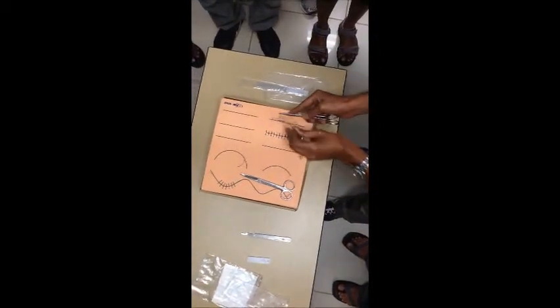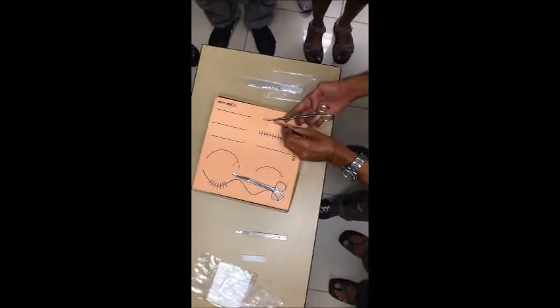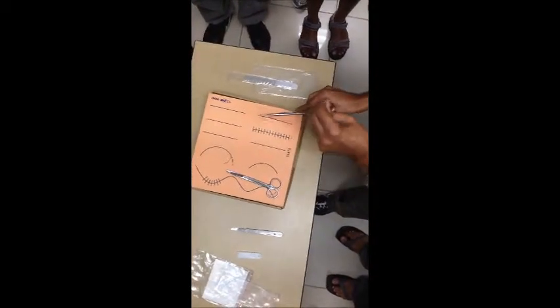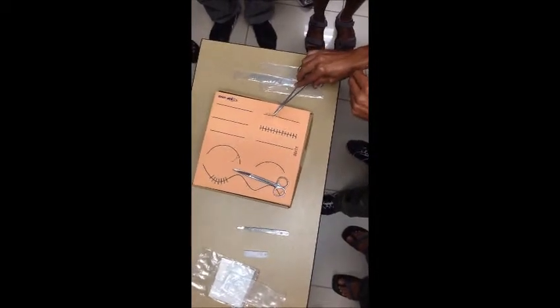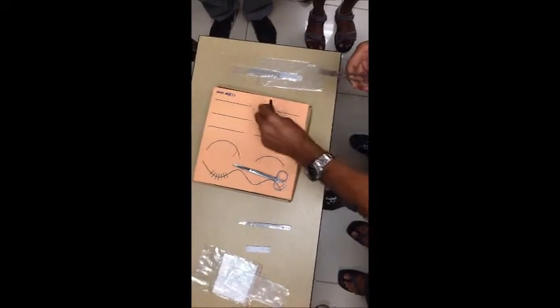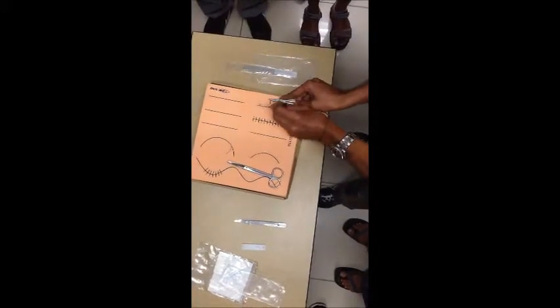Next bite and a full thickness bite, the other side. See? Now the suture line will come slightly obliquely. This is how we close the linea alba.